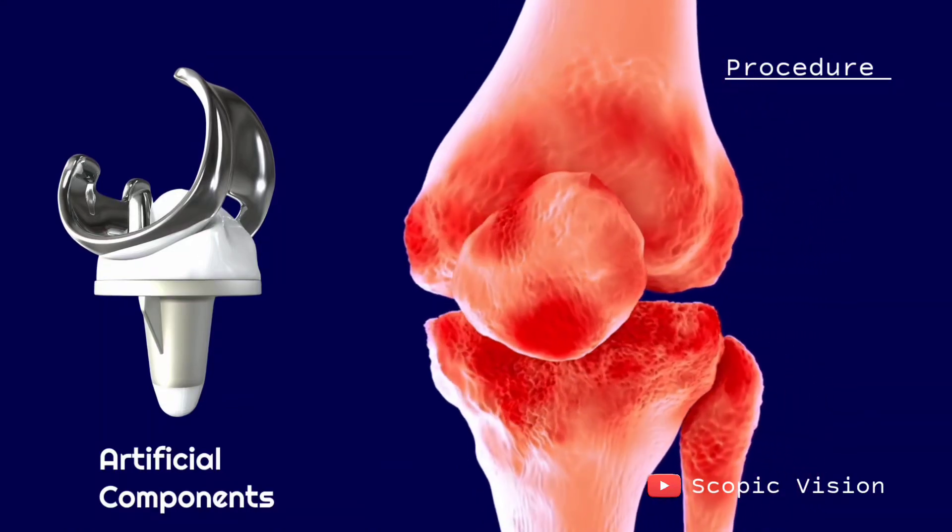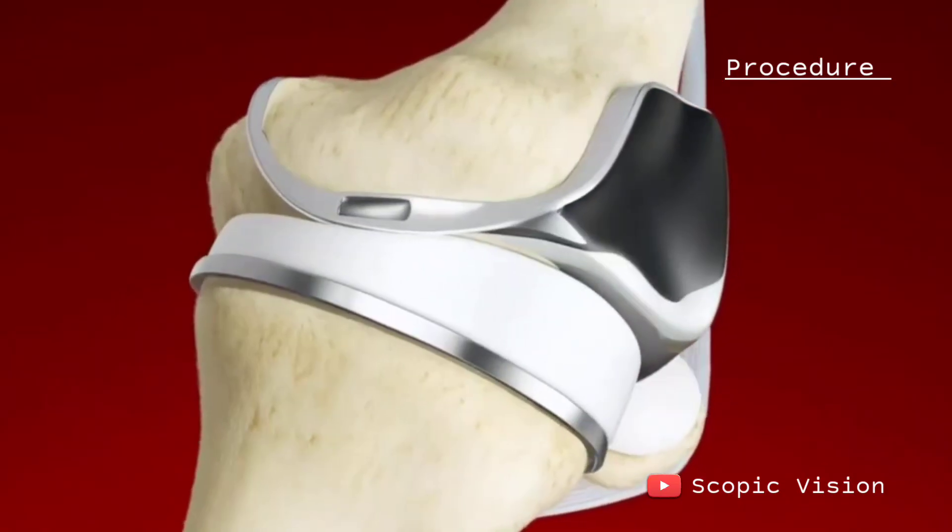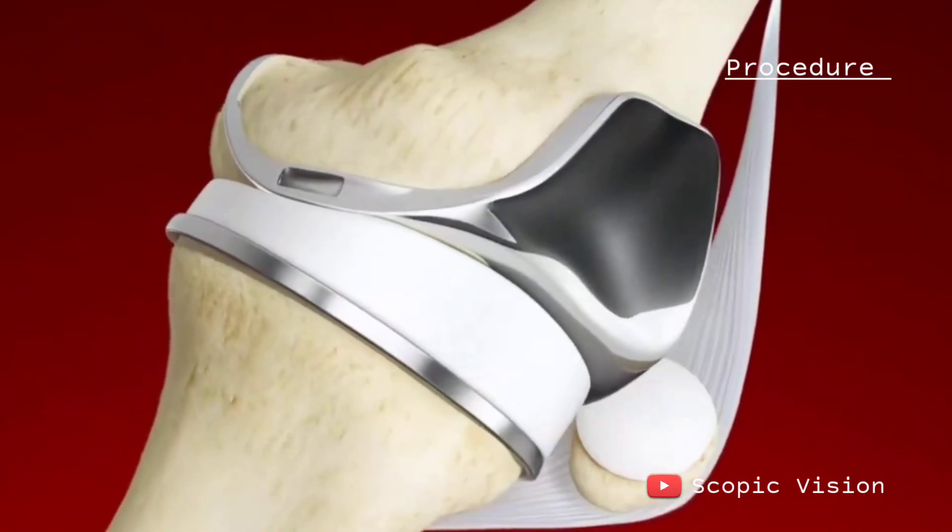The surgeon then prepares the underside of your kneecap to ensure it moves freely over the new joint, sometimes attaching a thin plastic piece to its back.